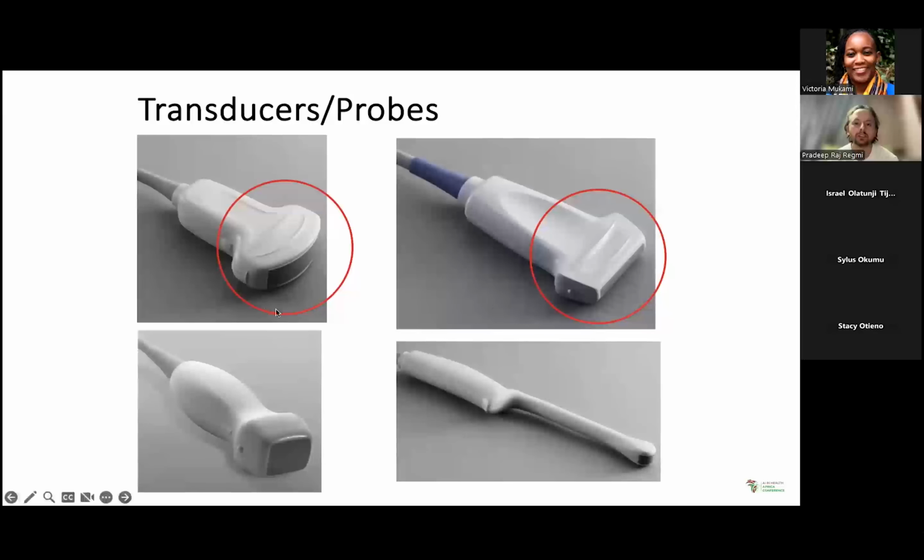And the transducer probes are also different to image the different anatomical structures. The first one is the curvilinear ultrasound probe, which has more depth penetration, so we commonly use it for obstetric ultrasound as well as normal abdominal ultrasound. The other is the linear probe on the right of the image, and it is used for the superficial structures like artery, vein, and nerves.